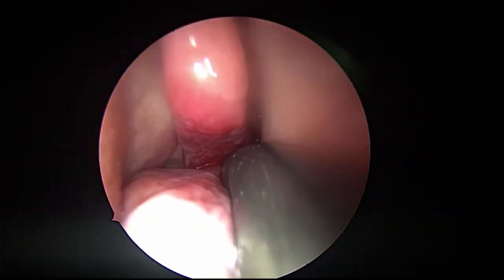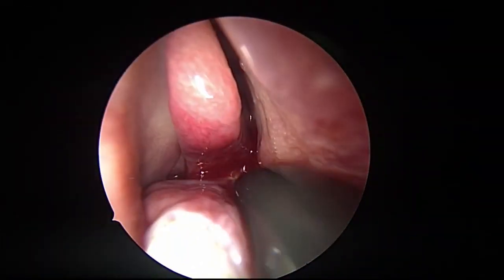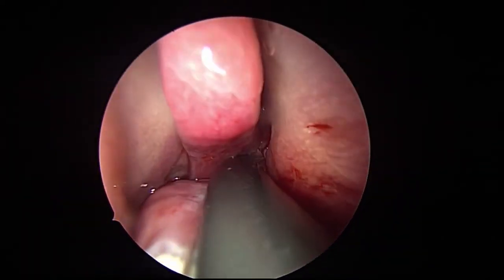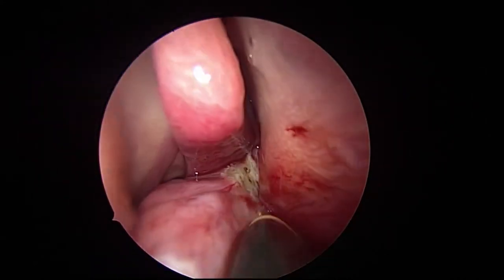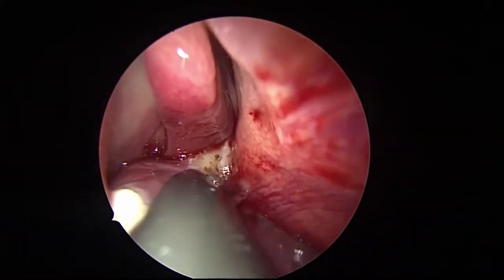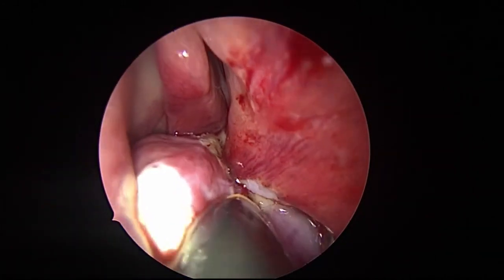See, such a proximal embolization is never going to work. You have to have a distal embolization at a microvascular level. If you catch the external carotid, that is not going to make any difference. That is not an end artery. See the tumor surface, and most of the bleeding is on the surface.